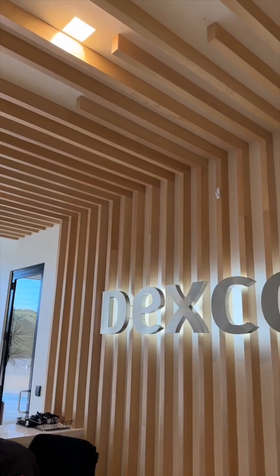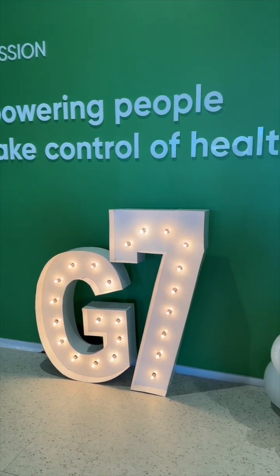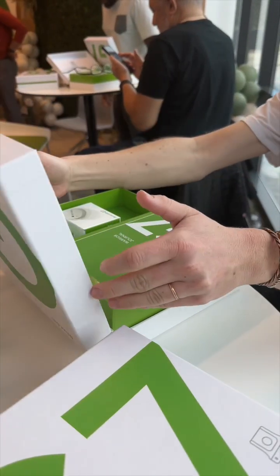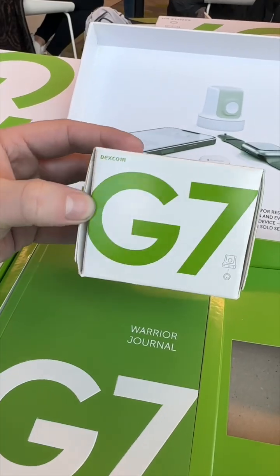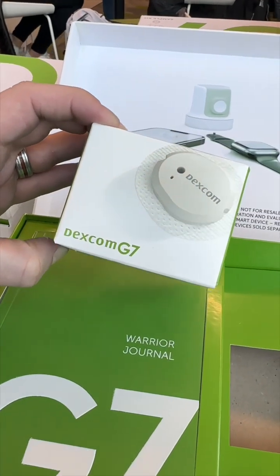The G7 is a continuous glucose monitor, not that dissimilar from what Apple is developing, that connects directly to your iPhone and soon the Apple Watch to give you a real-time measurement of your blood glucose level, which is great for type 1 and type 2 diabetics.